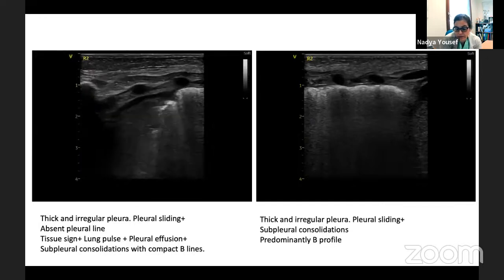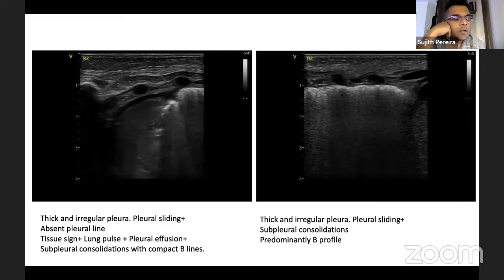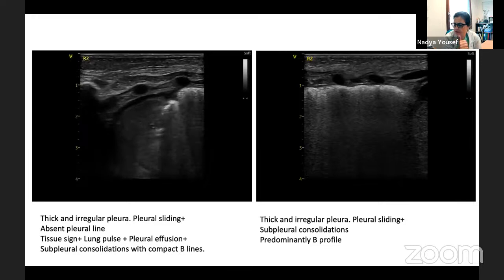So in the beginning, I thought that was maybe bilateral lung edema related to the really large duct, but it's not the same on the other side. No, I agree with you, Nadya, because even on the imaging, the chest X-rays, there's always a right side. You find that the changes are much worse than on the left side. So yeah, I don't know. That doesn't go with it, at least. There must be some degree of cardiovascular hemodynamic edema, but it doesn't explain this.